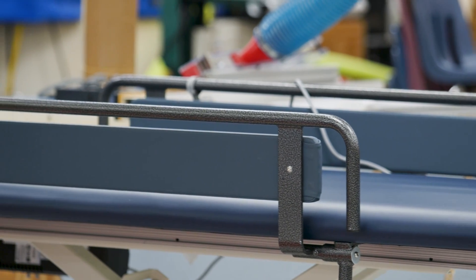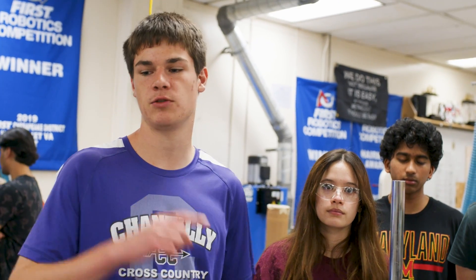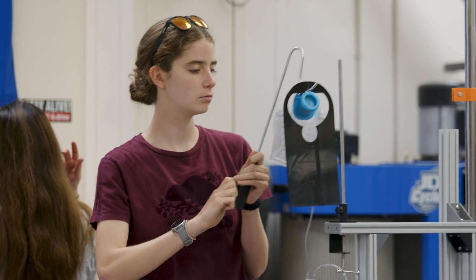We're trying to modify this bed for a student who has muscular dystrophy. We need to make sure we're able to accommodate him as he grows. The physical therapy class's part was to make sure the bed was functional and safe for the student and easy to get around school, and then the engineering kids took it from there and made our dreams come true.